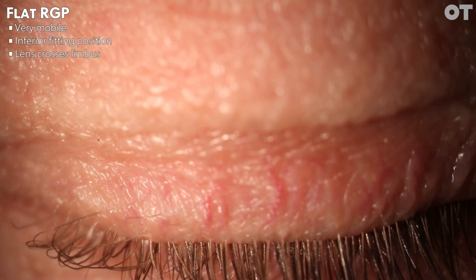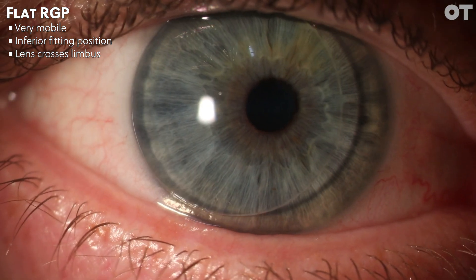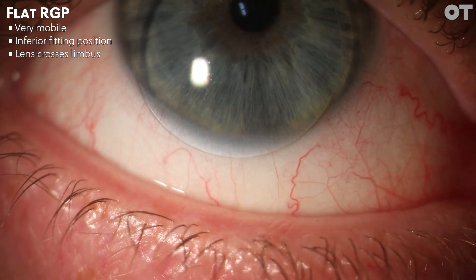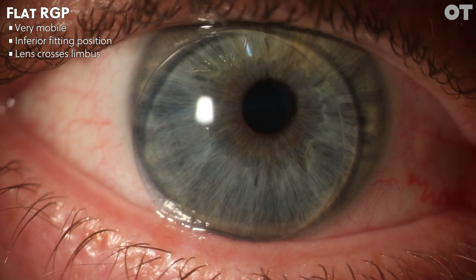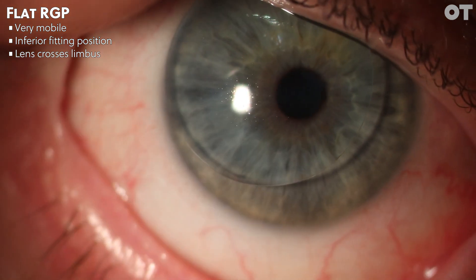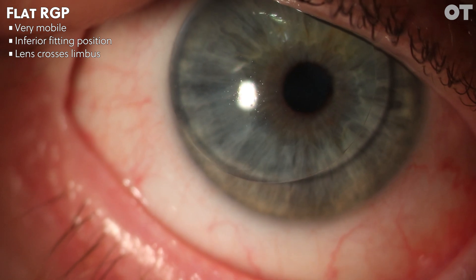So now we move on to a flat fitting RGP lens. Flat fitting RGP lenses tend to be very mobile, especially post-blink and on lateral gaze. As you can see, on lateral and upward gaze, the lens crosses the limbus. This video also shows a classical sign of a flat fitting RGP contact lens: when the lens is pushed up, we can see a recovery of the lens in an arcuate movement from top to bottom.